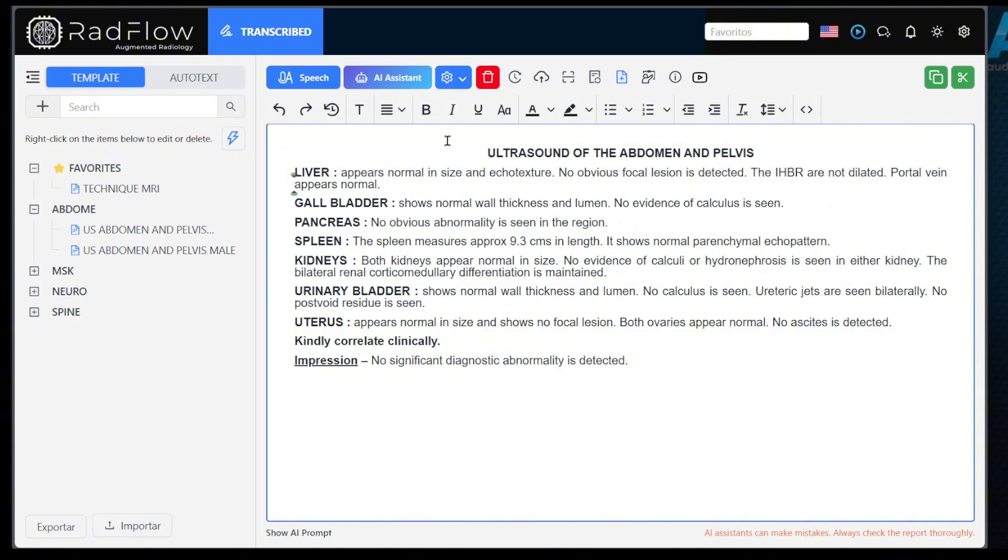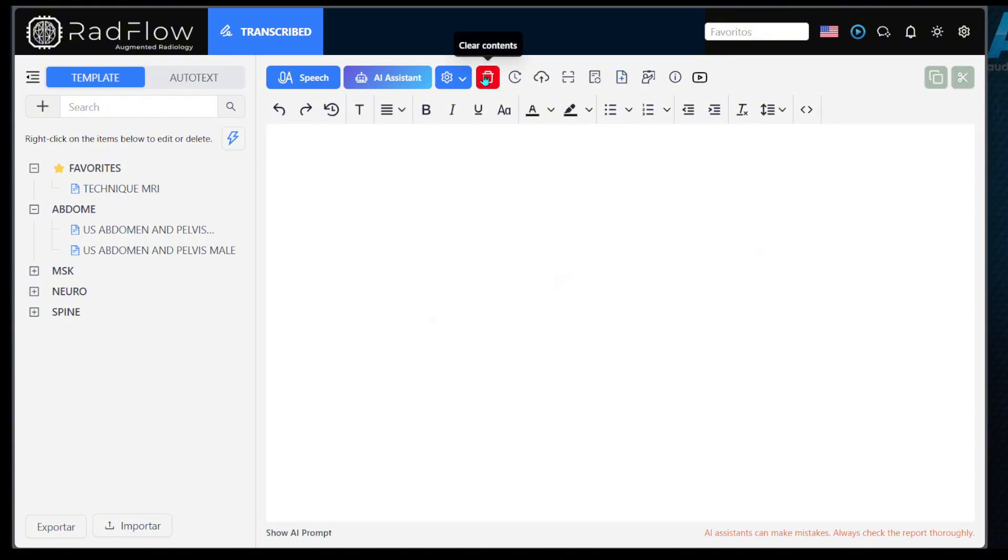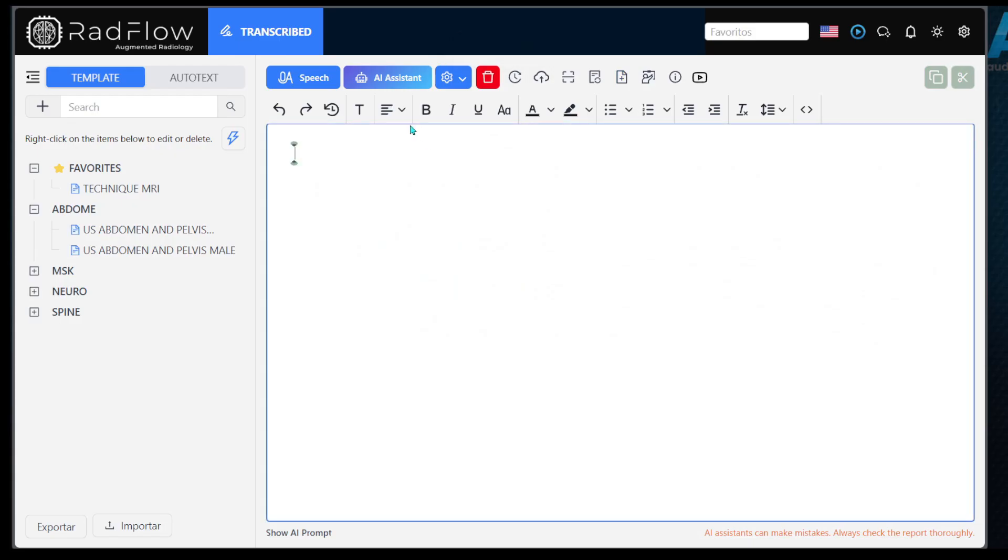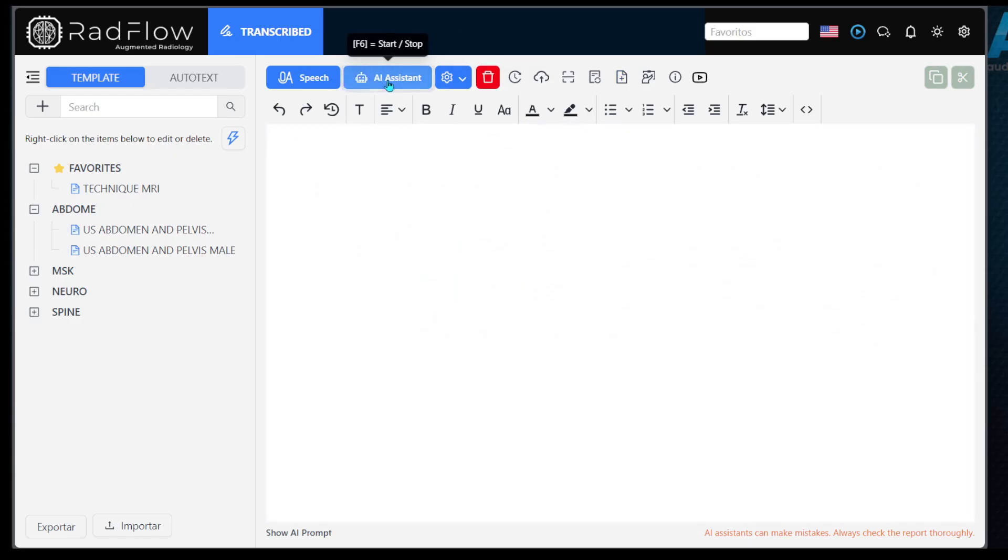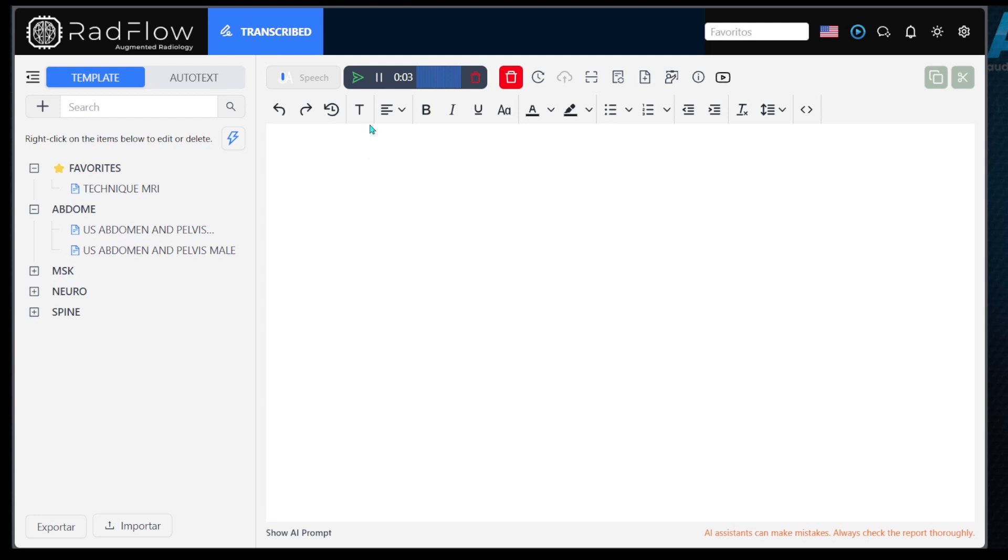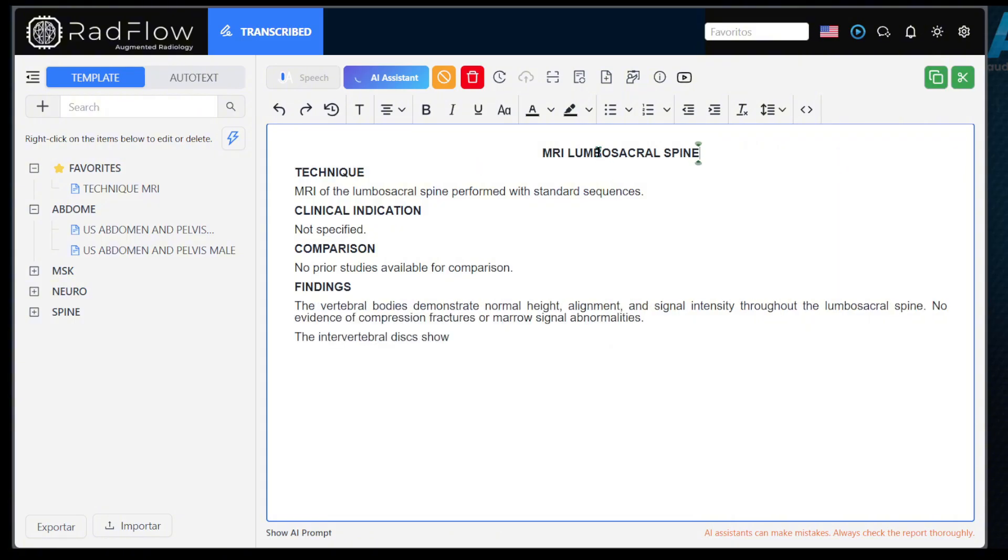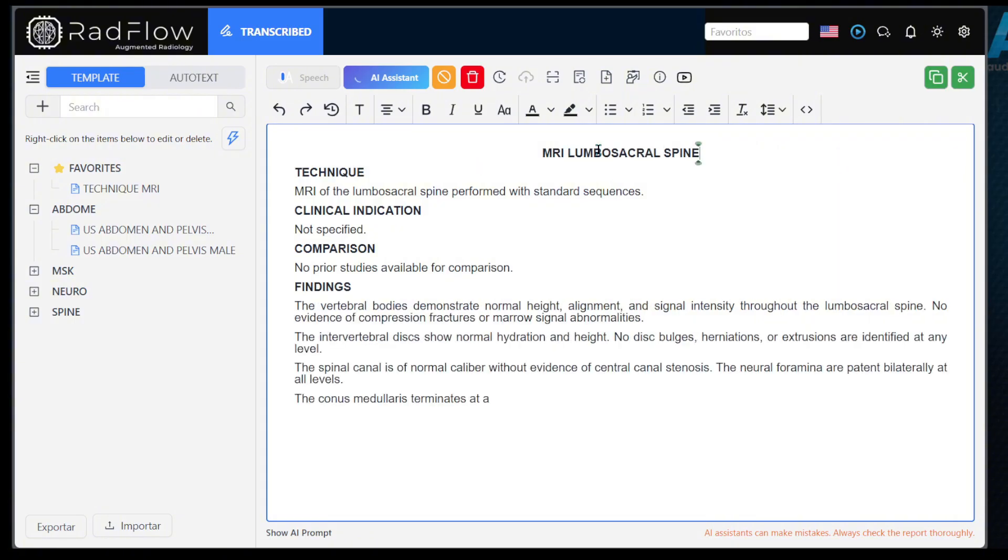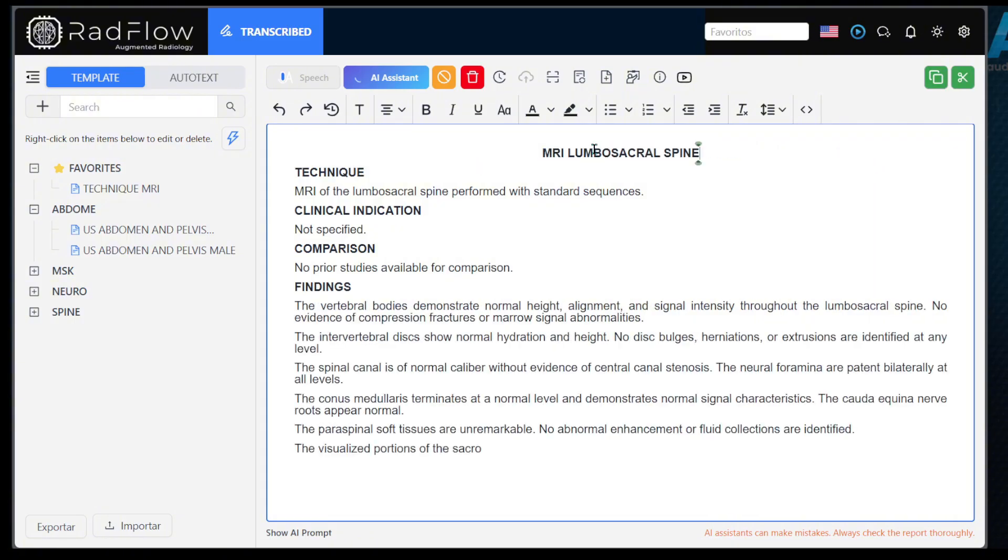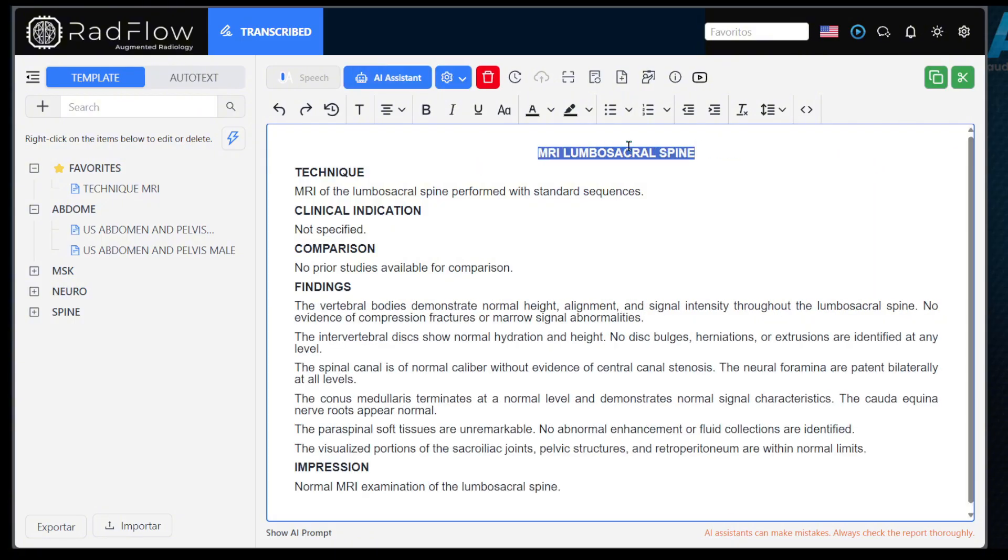If the editor is empty, the assistant will use the platform's standard models to create a complete report based on the radiologist's dictated findings. It is important to note that when the editor is empty, you must mention the study title at the beginning of the recording. This helps direct the system to the correct agent for the study being evaluated, ensuring a more precise report.